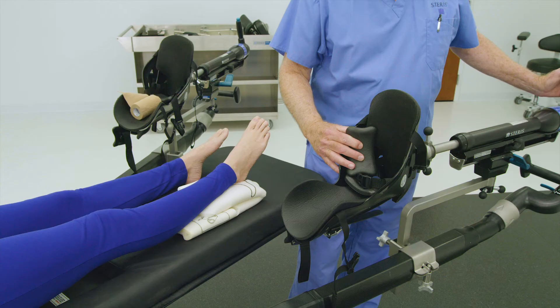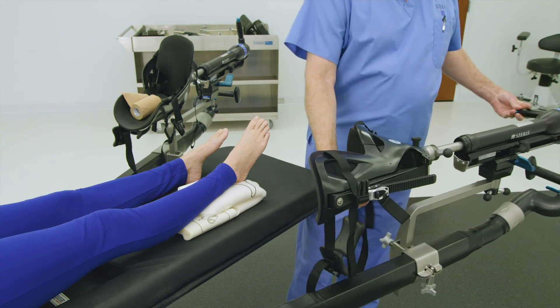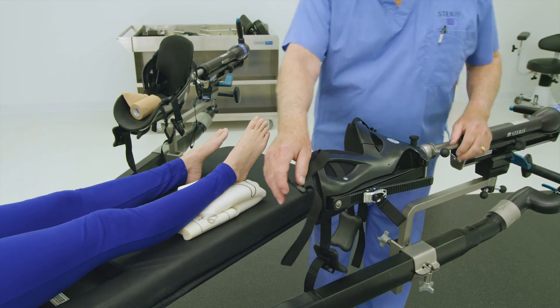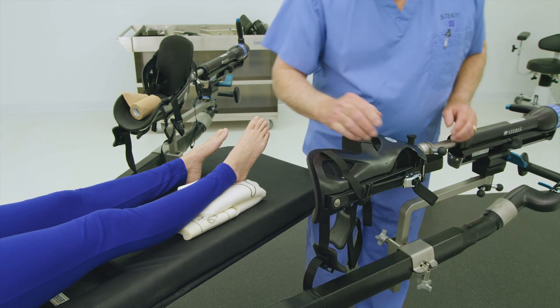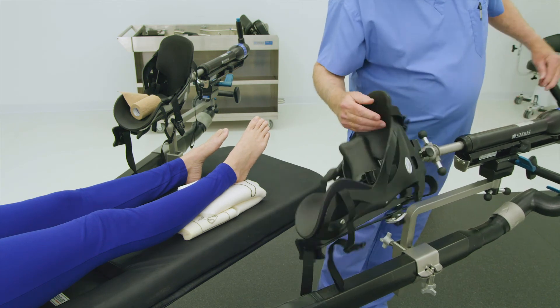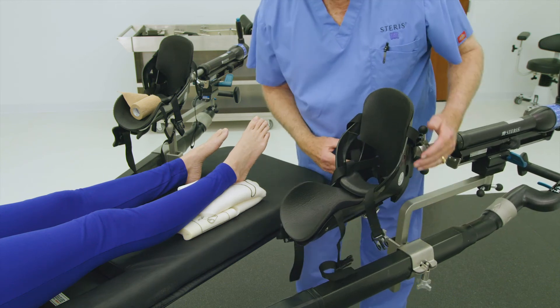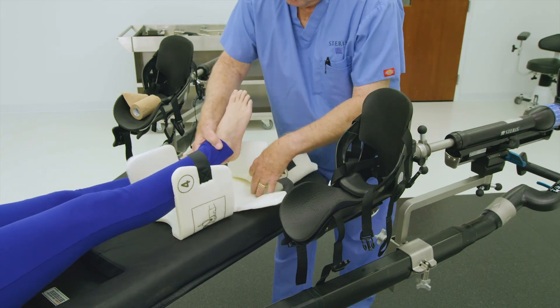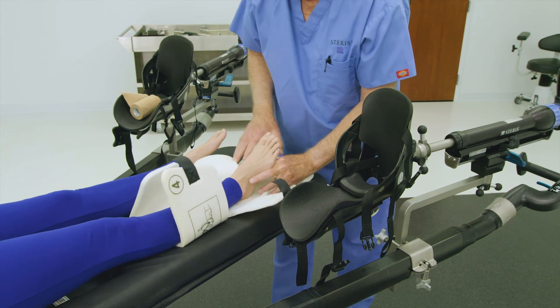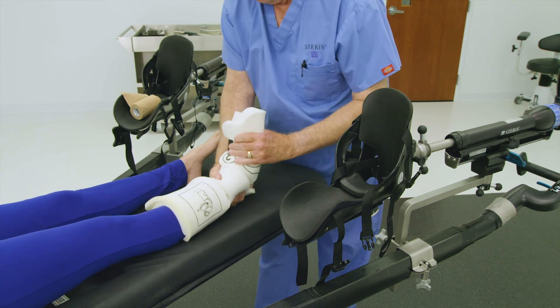Ensuring proper patient foot placement in the traction boot will secure the patient's foot when traction is needed. Complete the following steps to ensure proper alignment in the boot. First, loosen the middle strap of the traction boot by releasing the strap ratchet found on the back of the boot. Release tension by lowering the ratchet assembly to the bottom of the boot and loosen the strap by pulling outward. If the buckles on the boot straps are not released, open the three buckles by squeezing tabs and lathe straps over the exterior of the boot. Before placing the patient's foot in the traction boot, it must first be placed in a Steris traction boot disposable pad, or prepped using local OR materials such as gauze wrap and Coban.